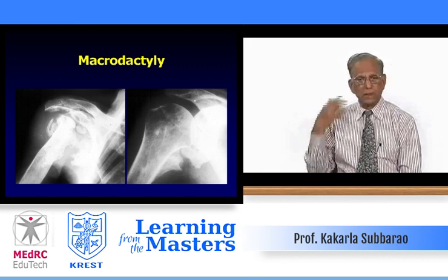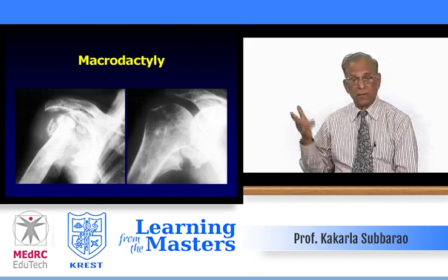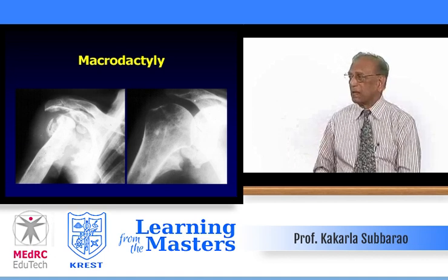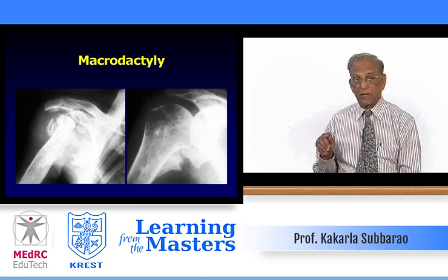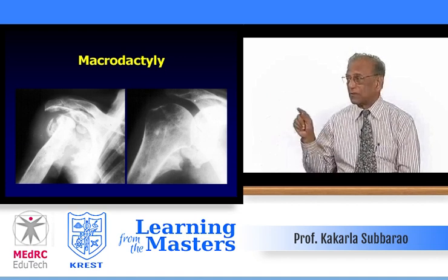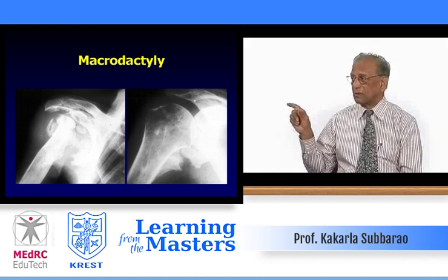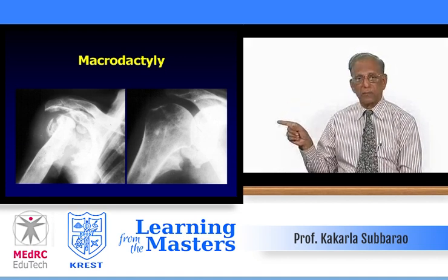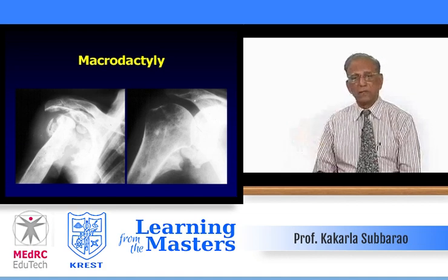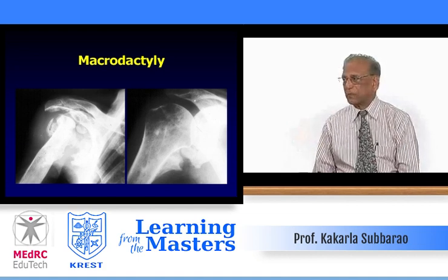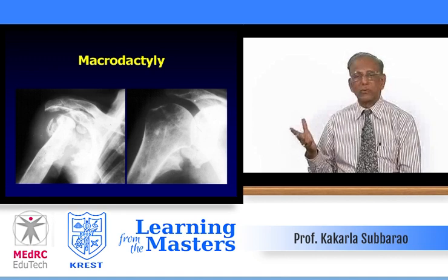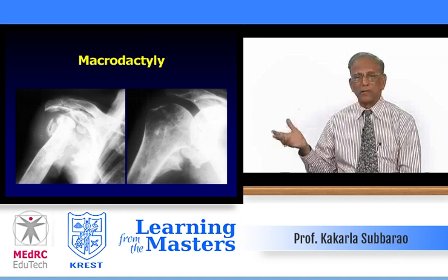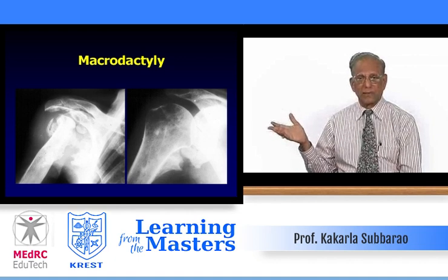In this particular case, syringomyelia or any lesion in the cervical cord or even the brain can produce this. On your right side, there is a triangular type of calcification on both the scapular surface and the medial surface of the humerus. It is dense ossification. This is post-traumatic. This patient has hemiplegia and post-traumatic myositis ossificans.